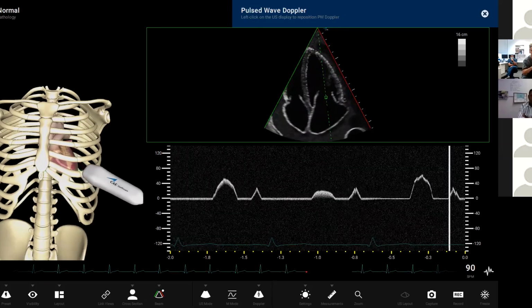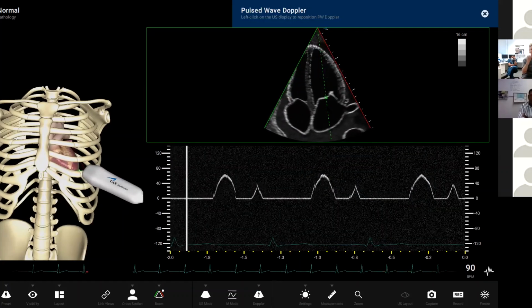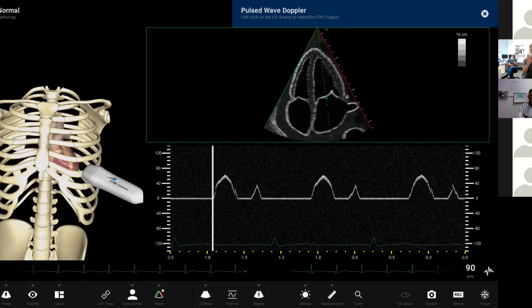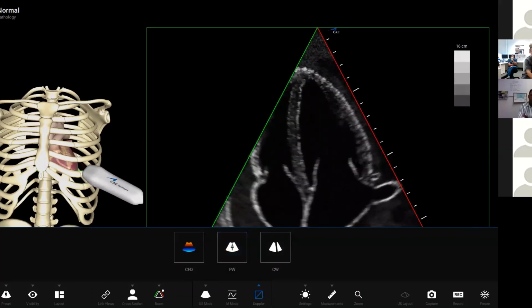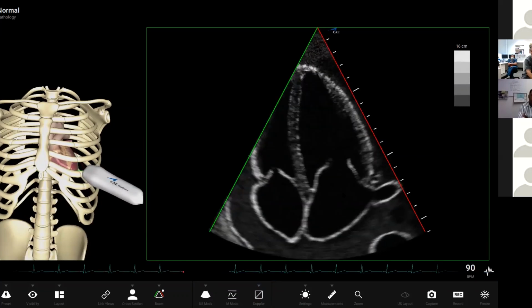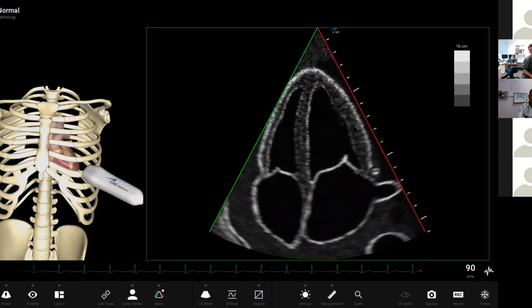So you've got your standard, beautiful 4-chamber view, and you can see that the blood flow is probably going in that direction. As the ventricle dilates and you get worse and worse systolic function, blood flow doesn't move in that direction, okay? So as you get a more and more dilated ventricle, blood flow, instead of moving in that direction towards the apex, becomes more and more lateral, okay?